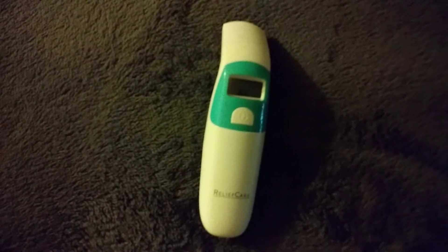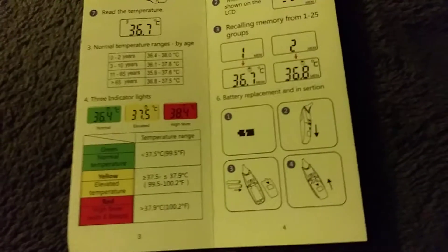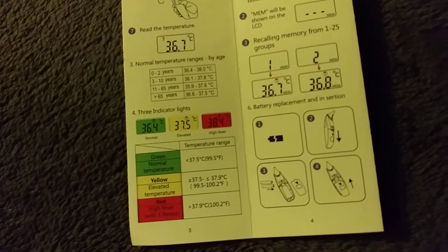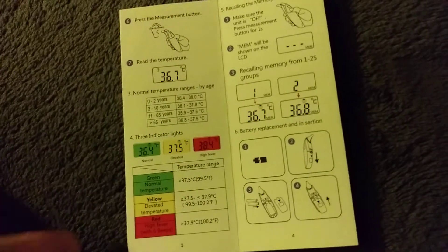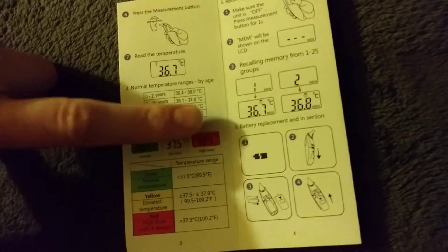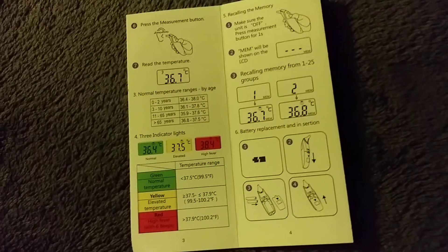As you saw, the thermometer lit up in green since my temperature was in the normal range. In the instructions, the company has given you a guide to temperature ranges and what they should be. The normal range shows green, elevated temperature shows yellow, and a high fever shows red — so that's an easy way to know almost without even looking at the temperature itself.